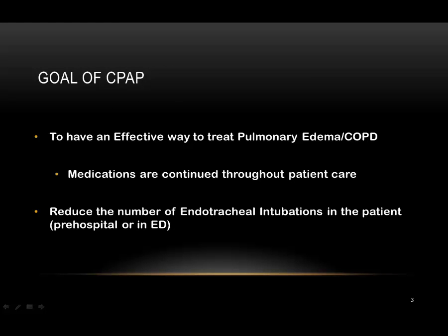The goal of CPAP is to help prevent the need for mechanical ventilation and intubation by delivering positive end expiratory pressure, or PEEP, while decreasing the incidence of barotrauma and volutrauma. It also helps EMS providers avoid complications from intubation-related sedation or paralysis, in addition to such unexpected difficulties as hypoxia, lethal dysrhythmias, tissue trauma, aspiration, and undetected esophageal intubation.